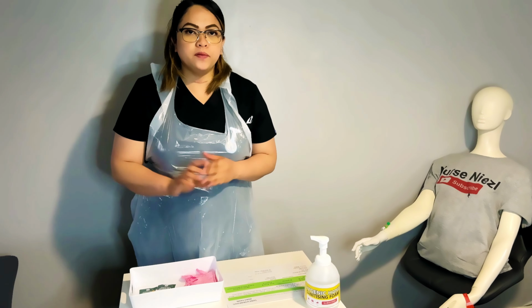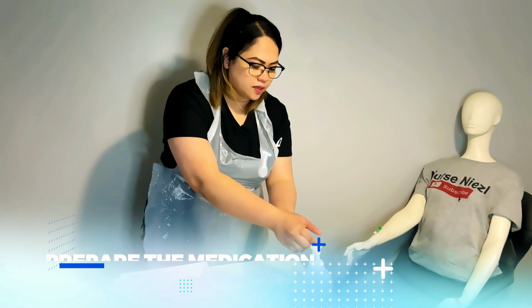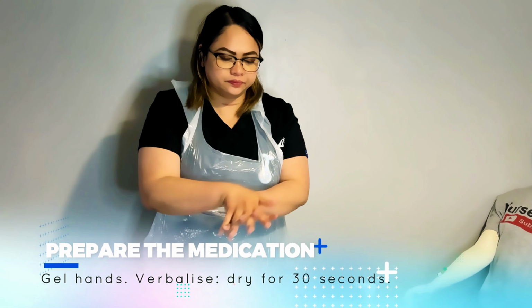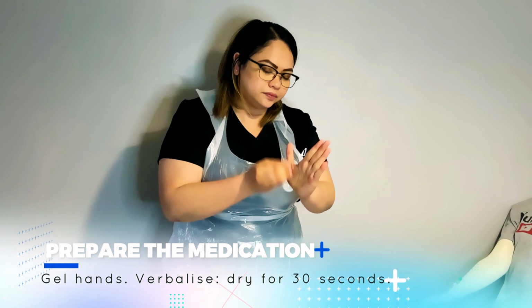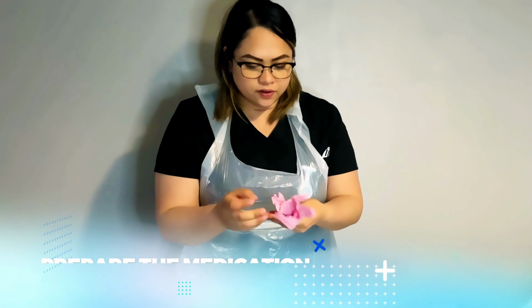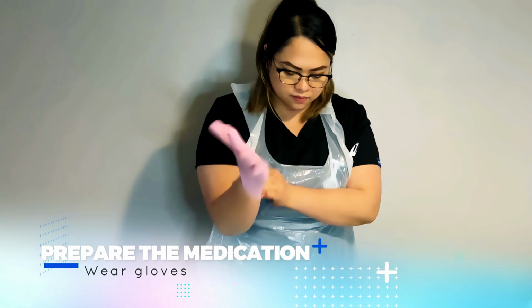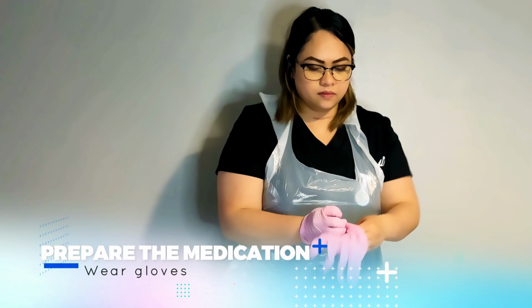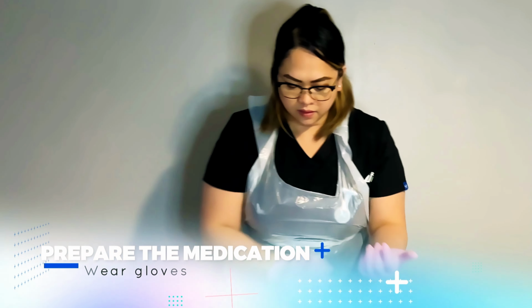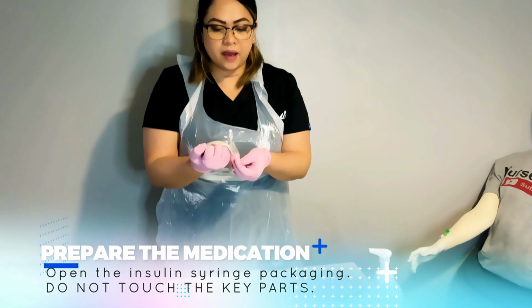Okay, so before going to the patient, I just need to prepare the medication first. So let me just gel my hands. Let it dry for 30 seconds. So first things first, I'll wear my gloves. Okay, the syringe, insulin syringe. Open the packet.